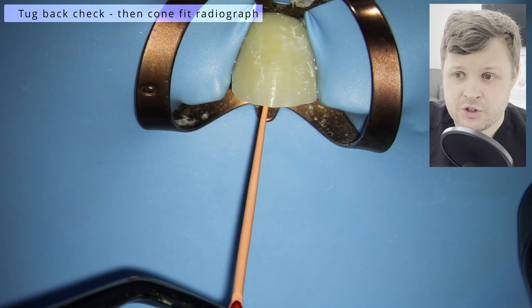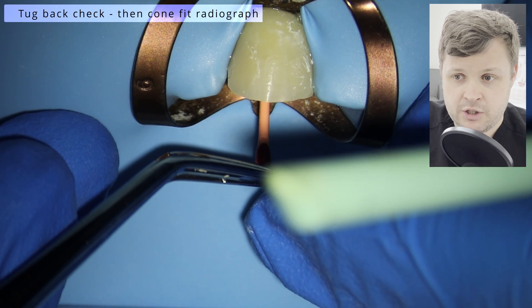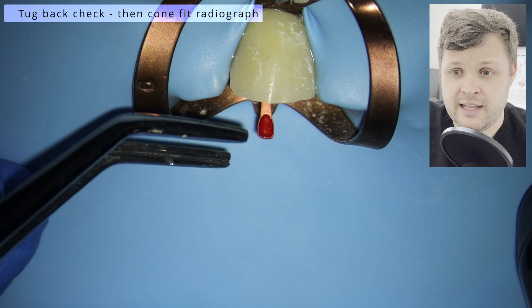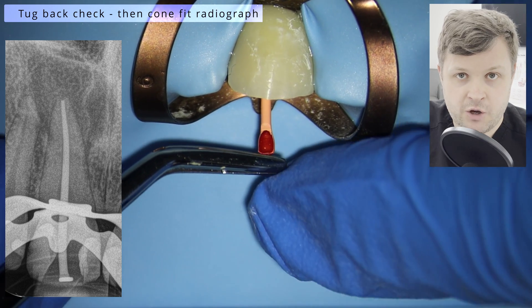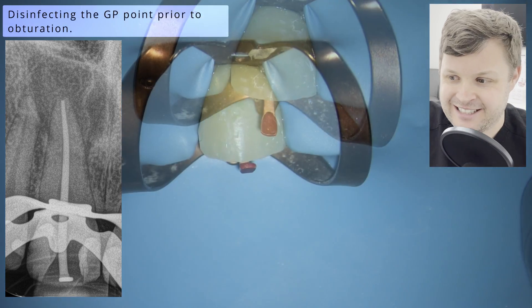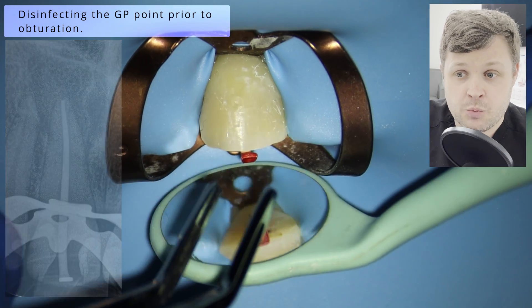We very gently push the GP point to length and feel for tug-back, just to make sure it's nice and snug at length. Then we take a confirmation radiograph — you can see here it's perfect. These are the kind of confirmation radiographs you want to see day in, day out. Really nice. So we're ready to obturate.